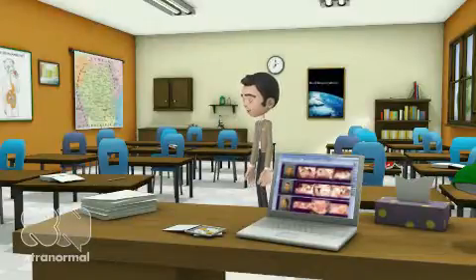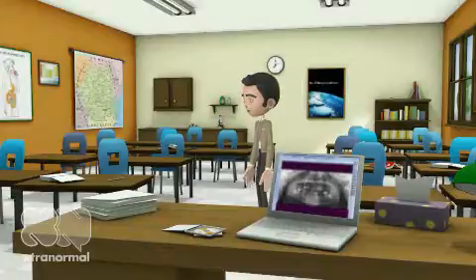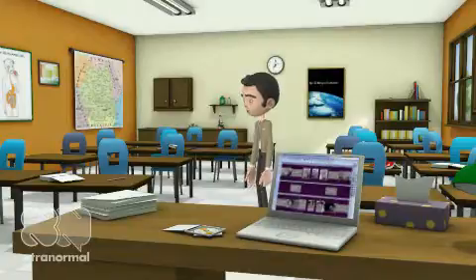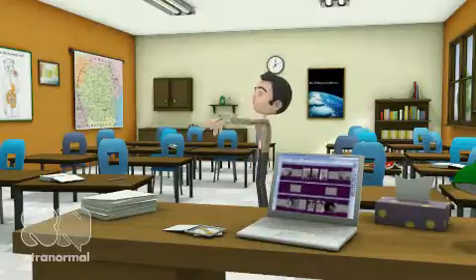The next thing you will want to do is to place the X-rays on the screen. Start with a pan, if there is one. Briefly discuss the general features, like multiple missing teeth, impactions, etc. It is not time to be detailed yet. Be patient. Now place the full mouth survey, or X-ray study on screen. Summarize what you see. Again, you are not ready yet to go ballistic. Hold on.